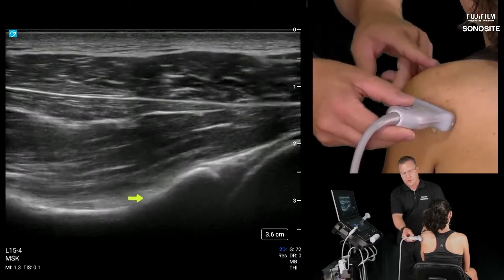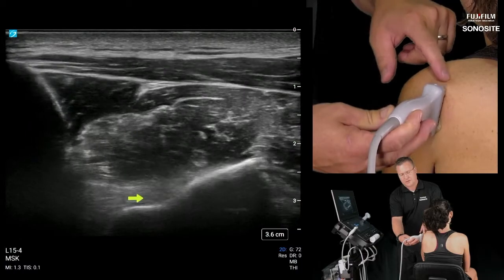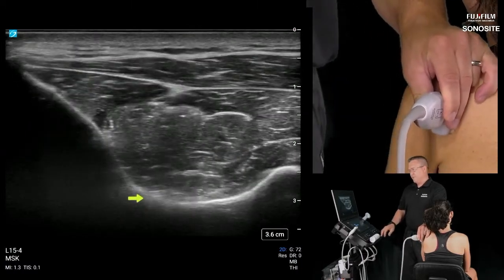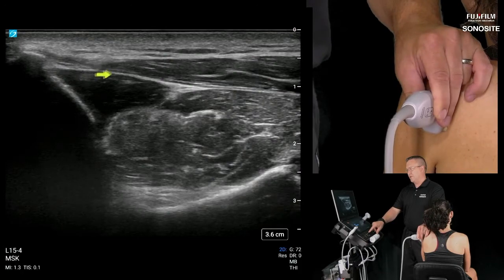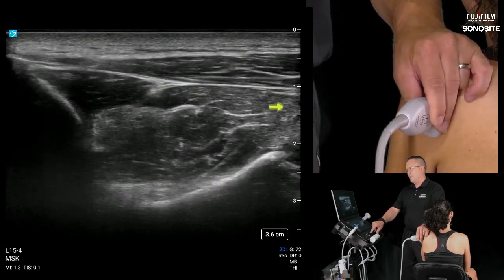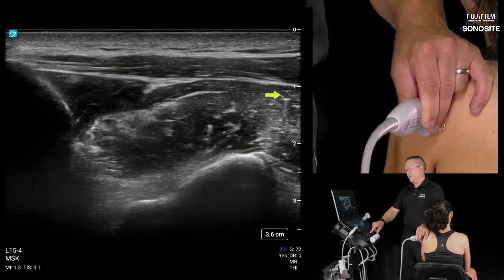So I'm just going to go transverse, and I have the left side of the screen facing superior up towards the spine of the scapula, which is here. So here's the spine of the scapula on the most upper screen left, and you can see where the infraspinatus begins right here, this whole corner. We're just going to follow it down all the way to here, and then that's that inferior glenoid right there. So that's about where you would stop visually evaluating infraspinatus.